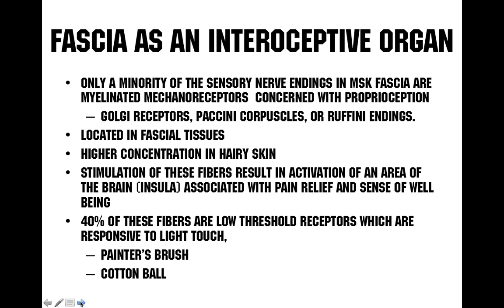Because, again, these patients coming to you are roughly in pain. Why do we want to put them face down and take a tool and drive it into their QL or their low back tissue and say, how you doing? It just doesn't make any sense to me. I don't think it makes any sense to the RockTape team to kill people's tissue and not let people be aware of what you're going to do to them.